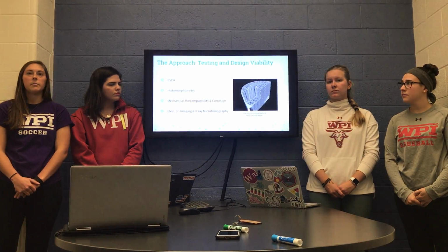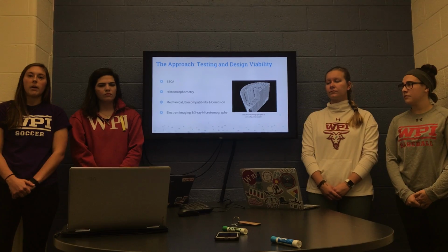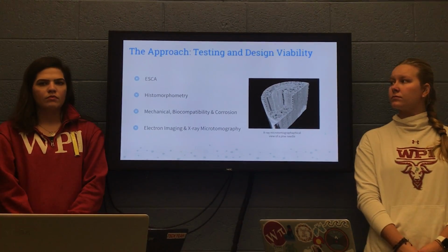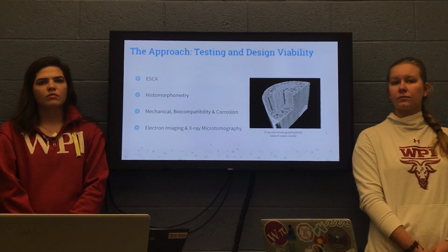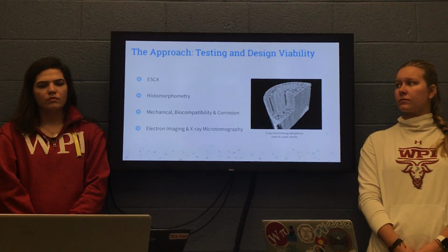And then to test the viability of our design, we wanted to overall make sure that it met all the FDA requirements, and also we wanted to analyze the osseointegration and analyze the bone ingrowth depth. So in order to do this, we chose to look at histomorphometry, ESCA, microtomography, as well as different corrosion and biocompatibility testing.